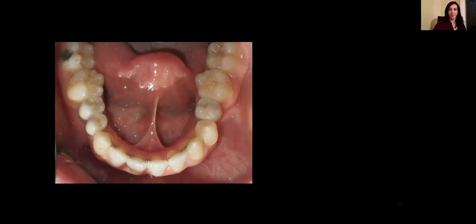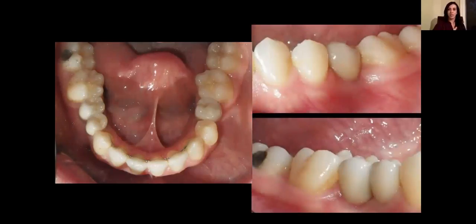So we've done 2 things over here. We've designed custom abutments with margins that are just 1 millimeter subgingival, and we've created this duplicate abutment that allows us to remove any excess cement prior to delivery of the crown. And by doing those 2 things, we really completely eliminate the risk of having cement caught subgingivally, which could result, as you can see, in a fistula developing.